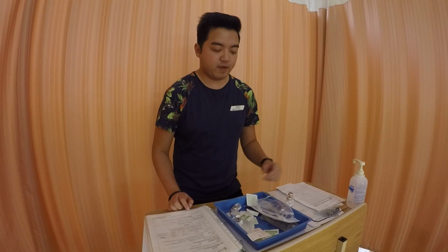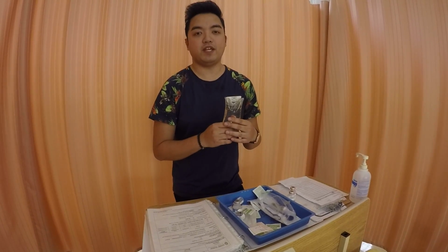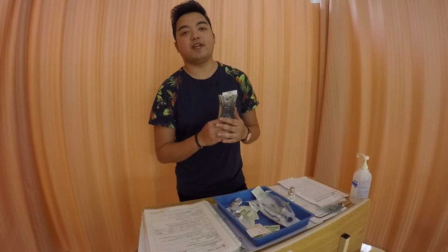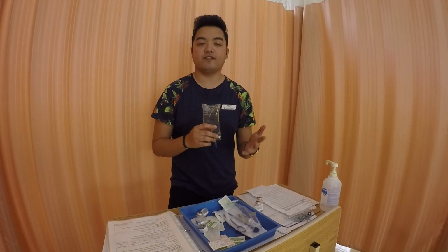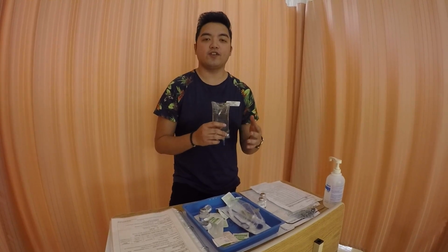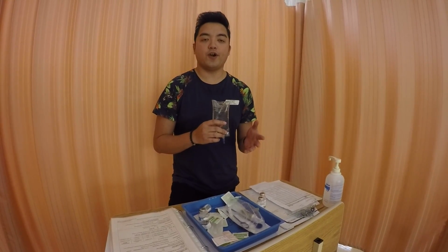So I choose to dilute the medication using a 100 ml normal saline and to run it over 60 minutes because though the patient has no known allergies, this is the first time that the patient, Mrs. De La Cruz, would be receiving cefoxitin. Therefore, I want the medication to be more diluted and to be given over a longer period of time just in case there would be an abrupt allergic reaction or adverse reaction, I can catch it easily, and also the risk for the patient having a much more severe allergic reaction would be lessened.